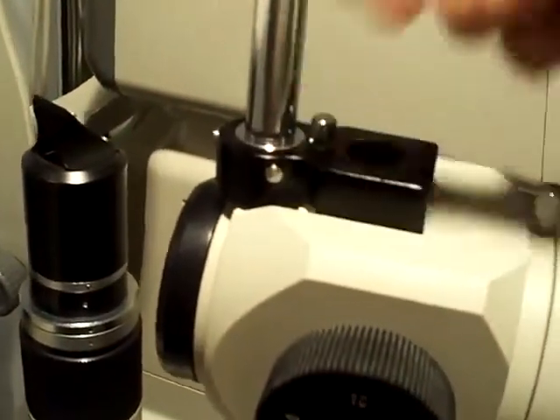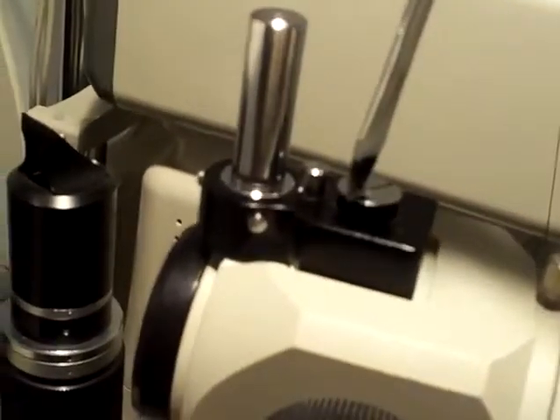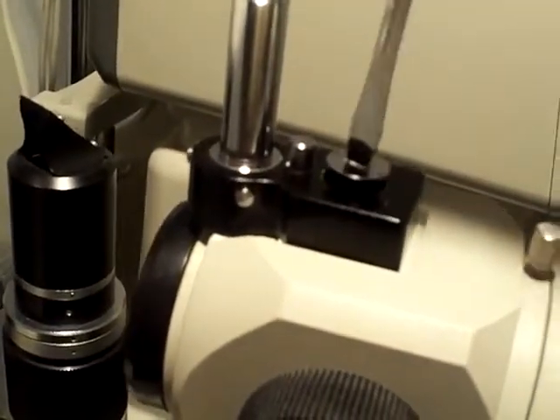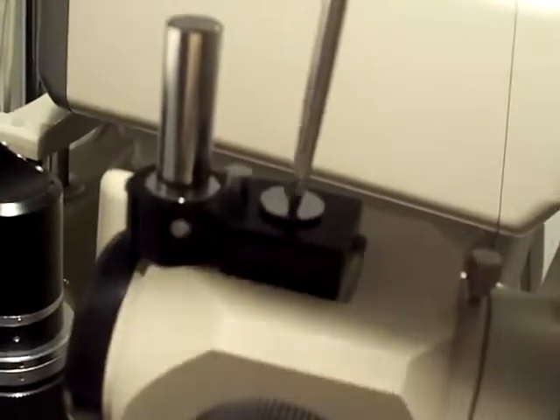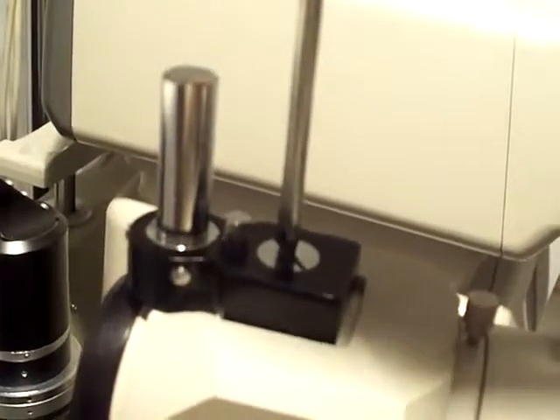And you just screw it in place. Make sure it's tight, otherwise you will not get an accurate reading with your Goldman Tonometer.